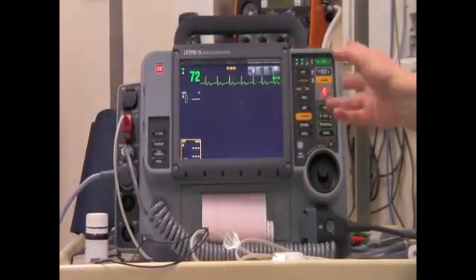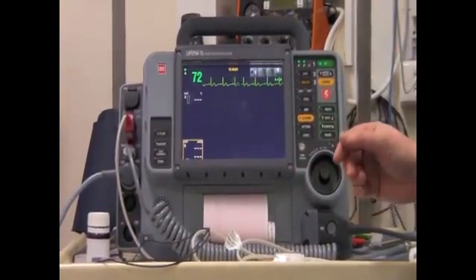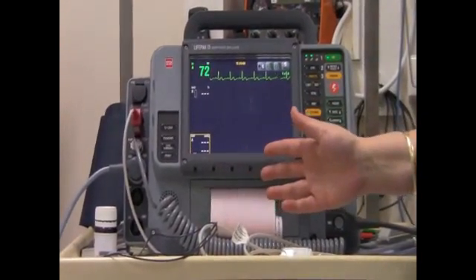And then the other thing is that down lower, you can see that that's blood pressure. So what you basically do is highlight it, you press select, and then the cuff will inflate and you'll get a blood pressure that's recorded. From there, you can also set intervals so you can have it regularly go off in 5-minute intervals if required to check someone's blood pressure.